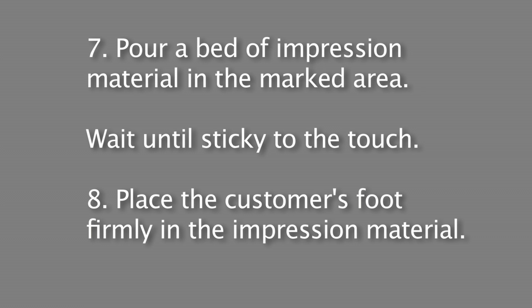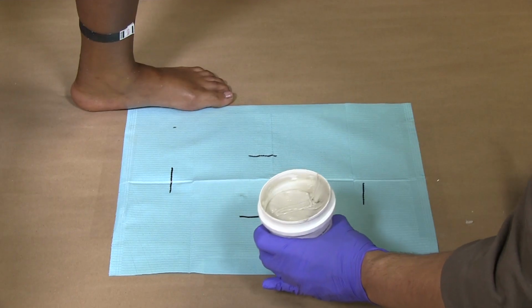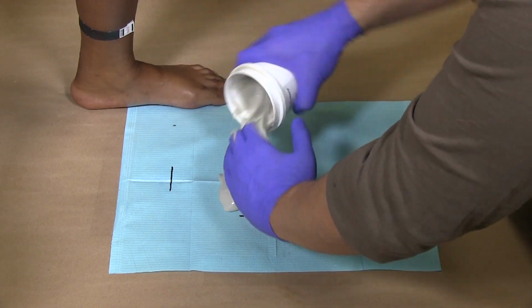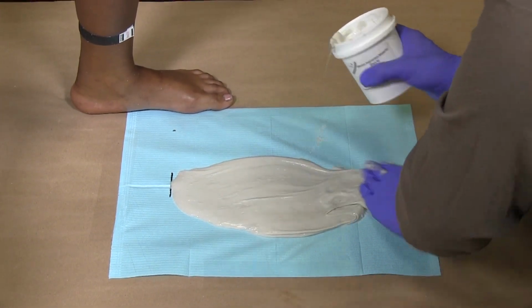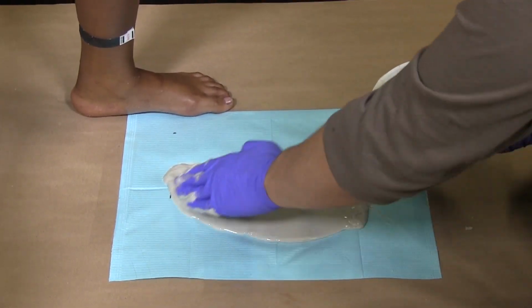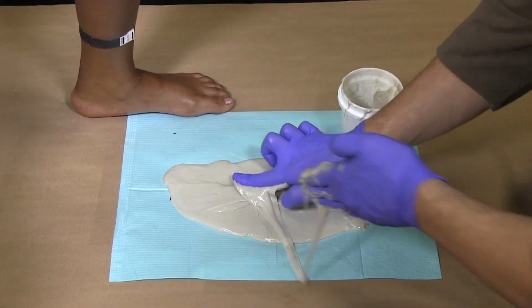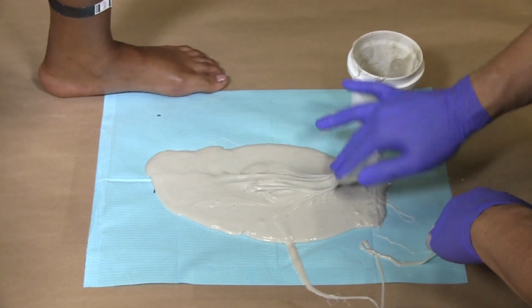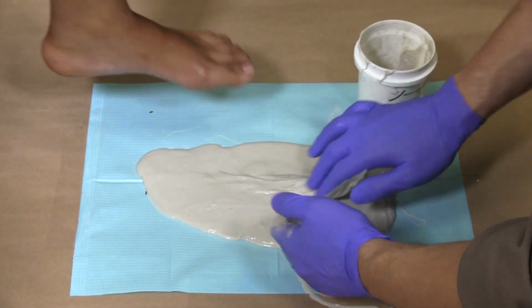To form the bottom of the impression, pour the activated impression material in the center of the mat. Try to achieve approximately 1/4 to 1/2 inch of thickness of material. Wait approximately 30 seconds to 1 minute until the impression material becomes tacky or sticky to the touch. This is to ensure a proper thickness on the bottom of the impression.